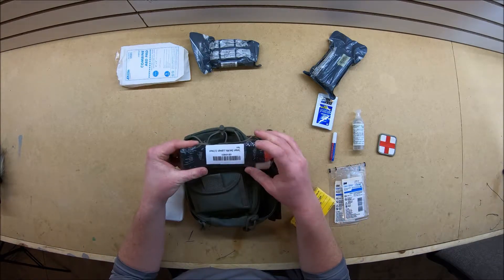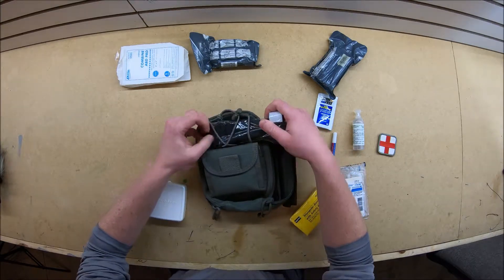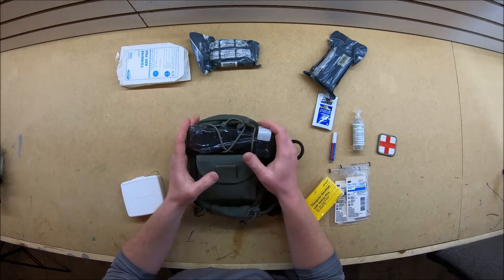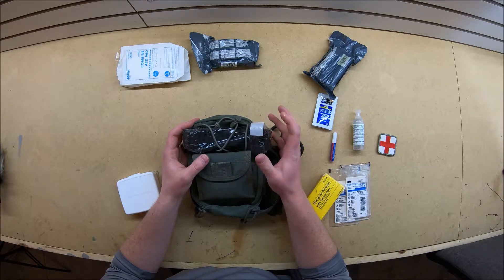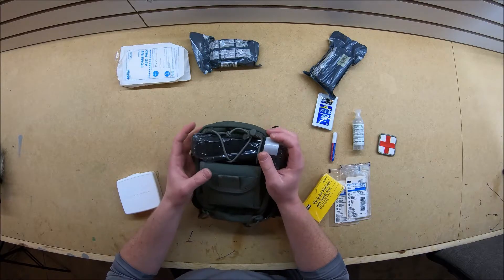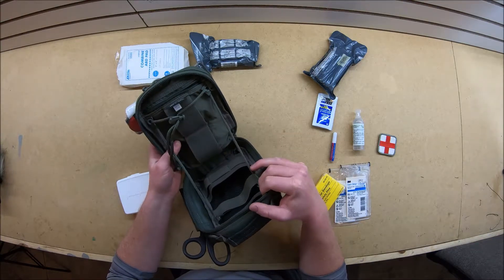Here we have a CAT tourniquet. Hope you never need that. That's definitely something I carry though in case of a gunshot wound while hunting, a chainsaw accident, or some sort of saw accident on a construction site. That's definitely going to help save a life if you have to use it.